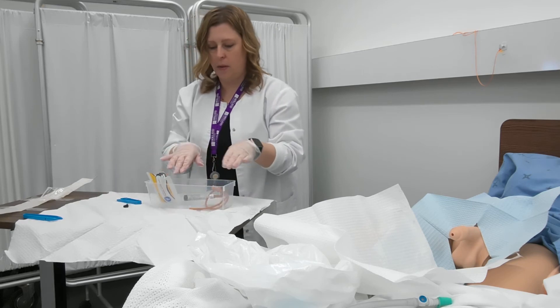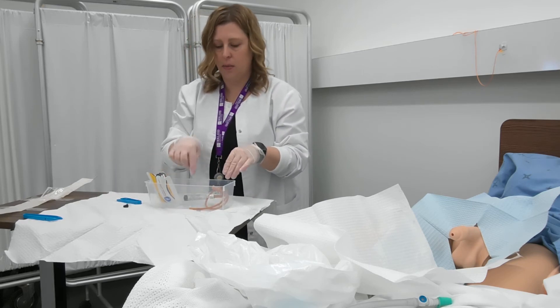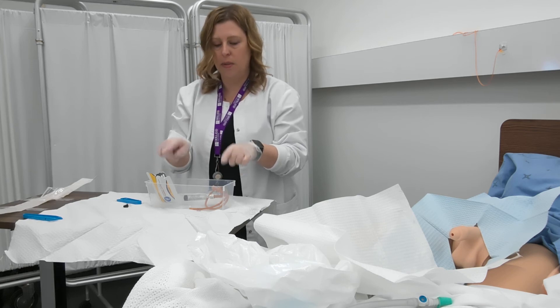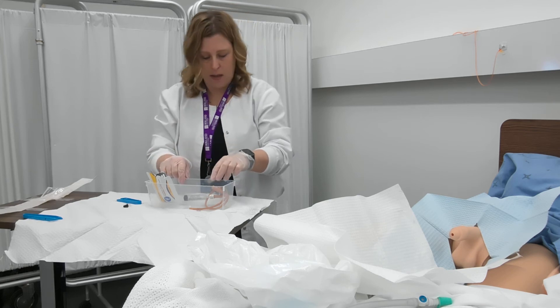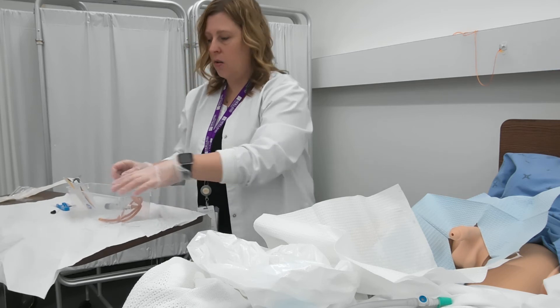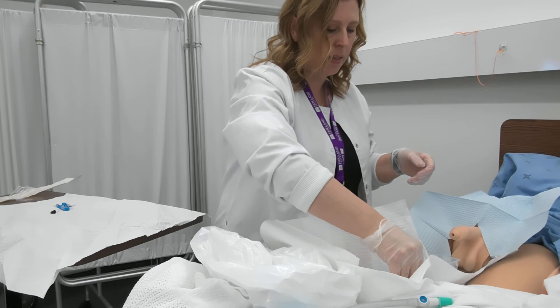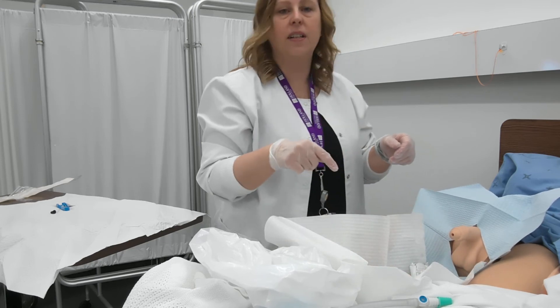Now I've got my catheter with the syringe attached in my kit, and I have the cleaning swabs, so I'm ready to go. I'm going to take the whole kit and place it between the client's legs in that sterile field.